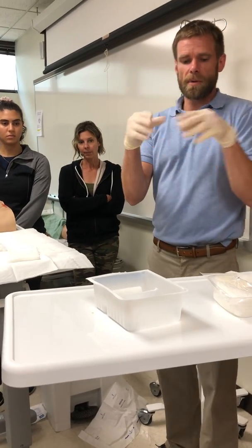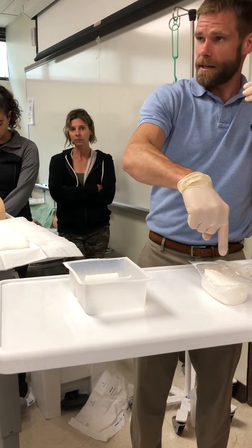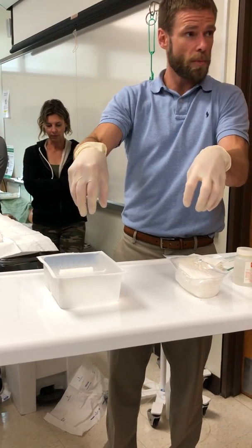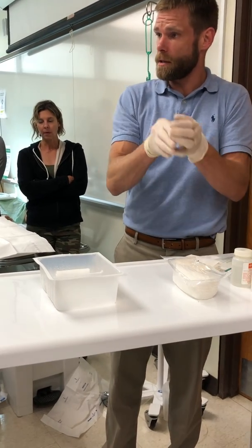Okay. You guys see what I've done here. If my kit comes with Curlex, I've done it inside this kit. If it doesn't, I did it this way. I have the two exact same things here. I'm just showing you how to do it both ways. If it comes with it, you can do it that way. If it doesn't, then you know how to do it. You get your own saline, you get your own Curlex, and it comes in a package like that.